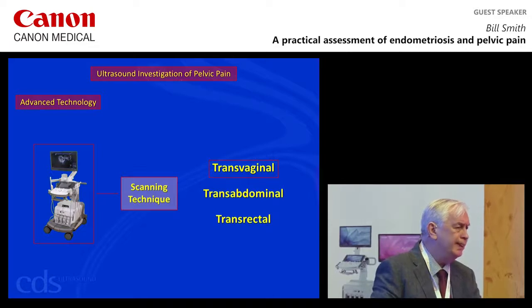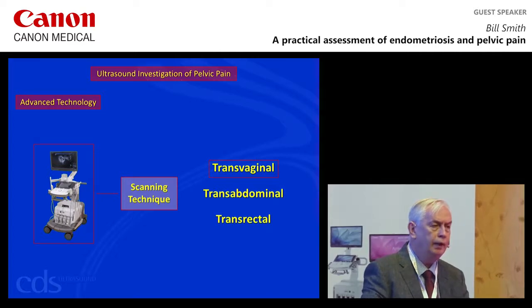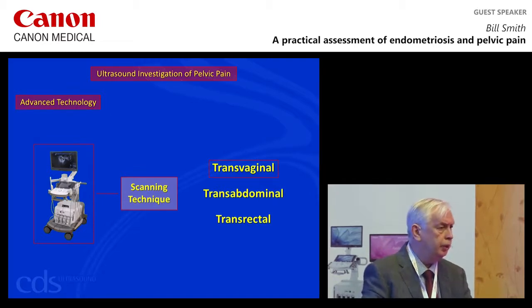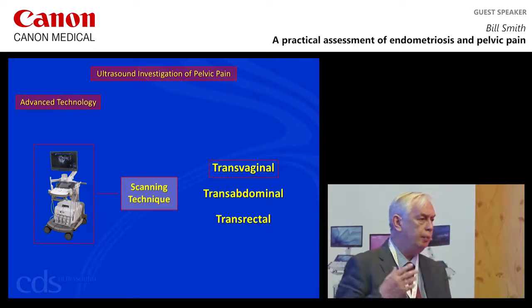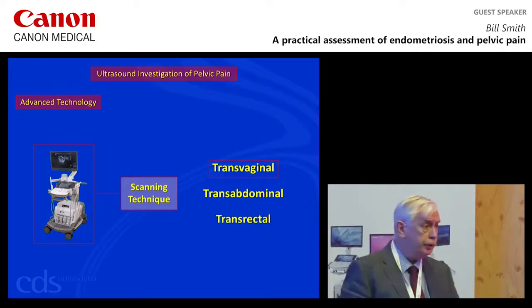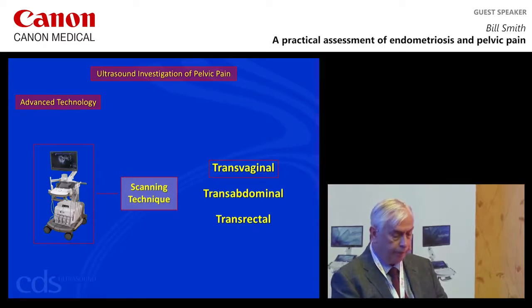Remember, gynecological disease is not confined to the pelvis, so there's still a very important role for transabdominal scanning. And really, if we're not competent at renal scanning, liver scanning, abdominal aorta, bowel, etc., we're not competent at gynae scanning. We have to adopt this flexible approach and be competent. And certainly from an endometriosis point of view, there's a considerable role for transrectal scanning.